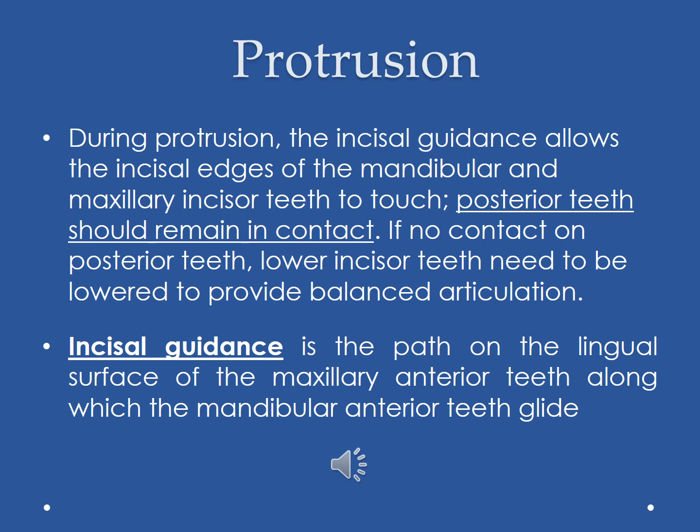During protrusion in complete denture, the incisal guidance allows the incisal edges of the mandibular and maxillary teeth to touch. The posterior teeth should remain in contact. If there's no contact on the posterior teeth during protrusion, lower incisor teeth need to be lowered to provide balanced articulation. So we're playing with the incisal guidance here.